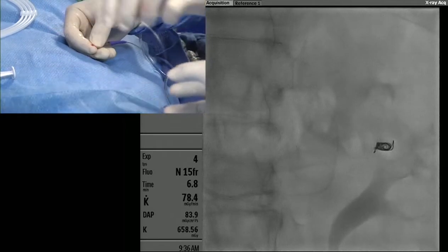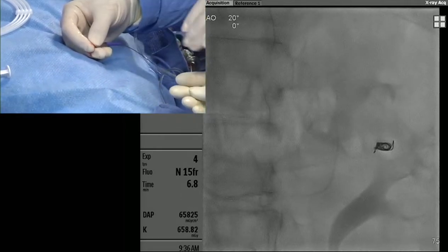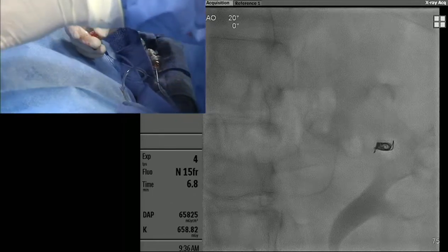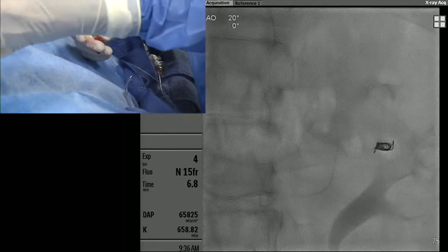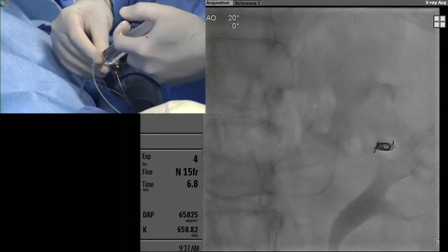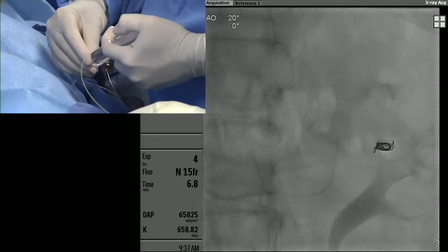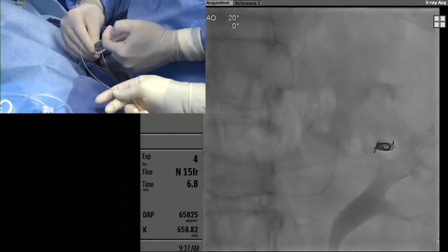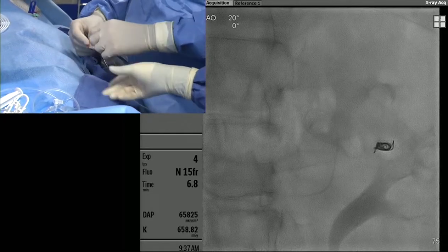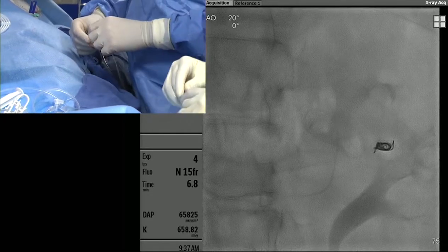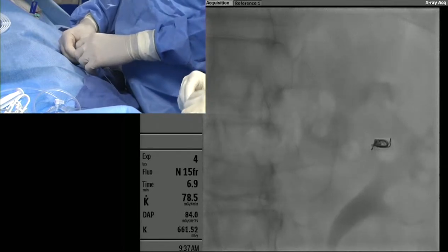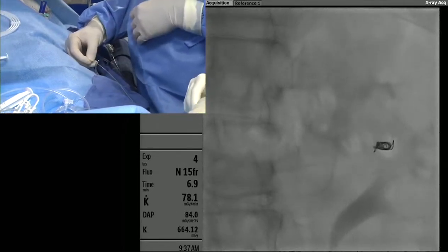That is the mechanical detachment that the Interlock allows. We'll show you a couple more coils over the course of this case to give you an idea of the different detachment mechanisms. For this specific coil it's a very simple snap detachment — you can reposition it, as you saw, and it's not until the radiopaque snap exits the microcatheter that it's truly separated.